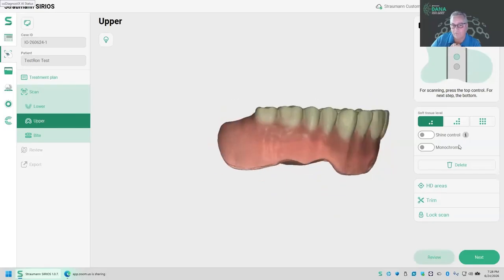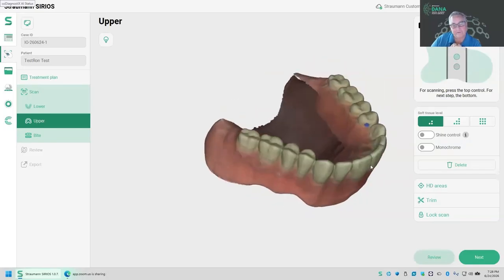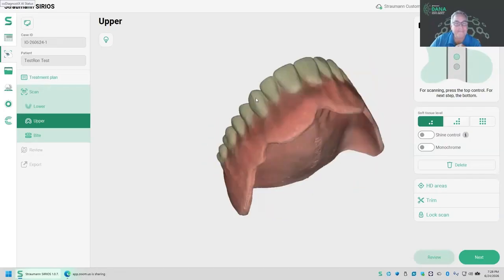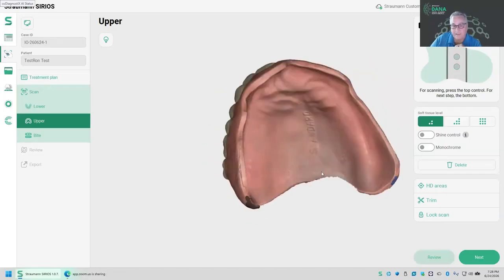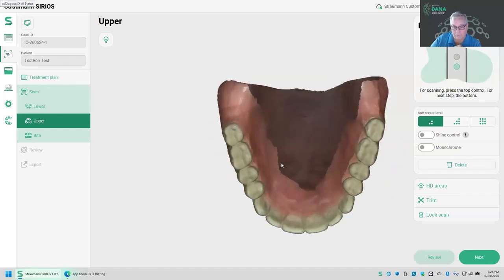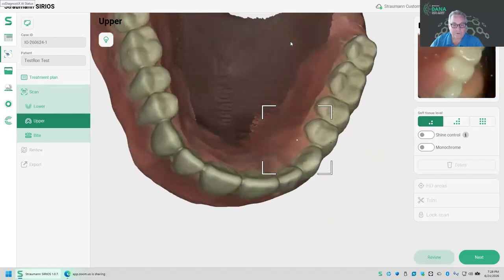But we have all the critical, we have the dentition of the, oops, I got a hole, I got to get that. Mesial of the upper right first bicuspid, okay. So we have the intaglio, we have the flange, we have the dentition, okay? So filling in the palate is going to be last because it's the least important surface to capture and the most difficult at the same time. So let me go ahead and fix that hole first, okay?